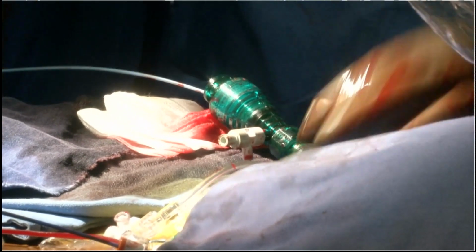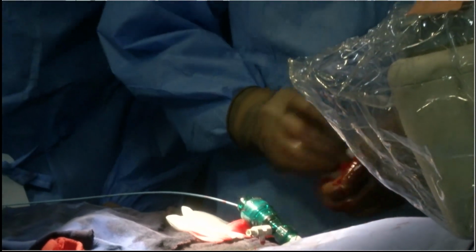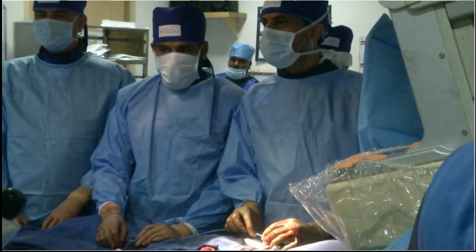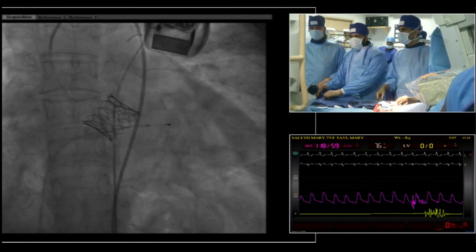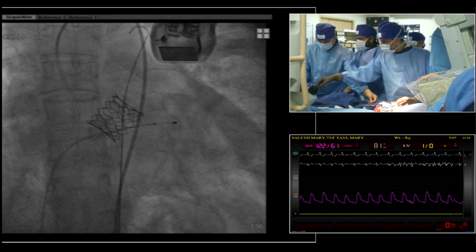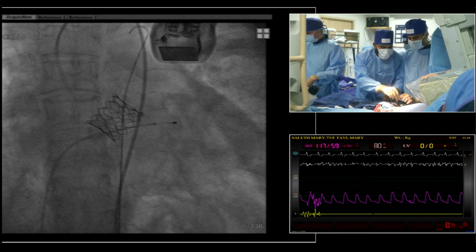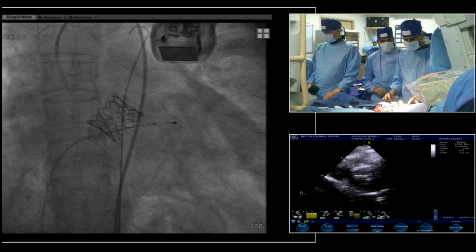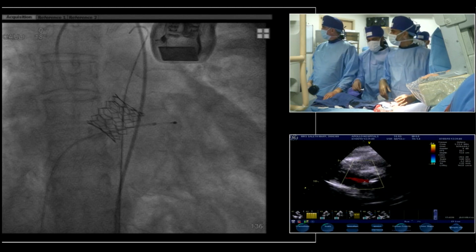Okay. So the best strategy I think about heparin is never reverse it completely. Agree with the fact that after you close, you reverse it partially. Because after all, you've sutured the artery, you actually had devices in, and you don't want thrombus formation of any sort. Getting half the heparin down is good enough, and let the rest of the heparin wear off, and that avoids thrombotic complications in a big way. It is not, in fact, necessary to give protamine if you get good complete closure. There is no ooze, it's okay. It varies from center to center. Many times we don't need to give protamine at all.